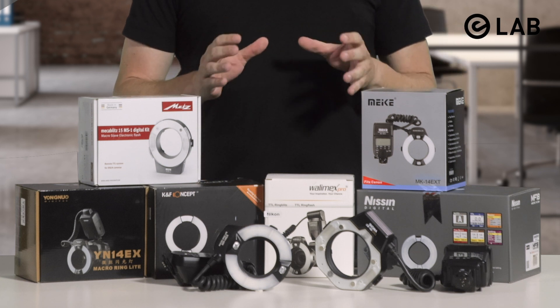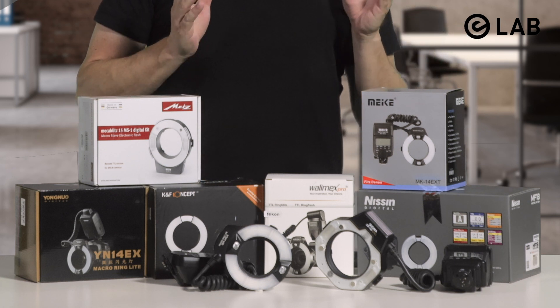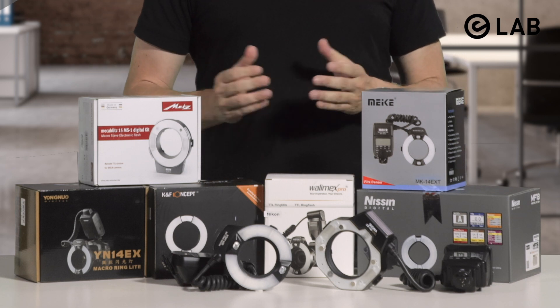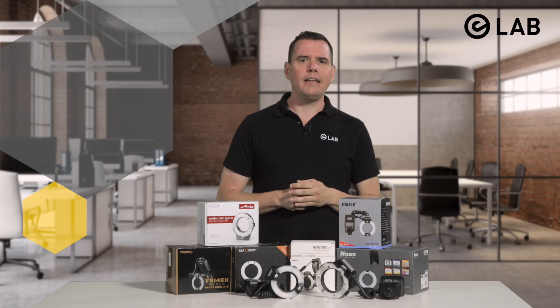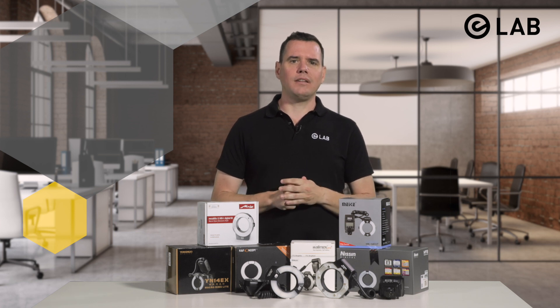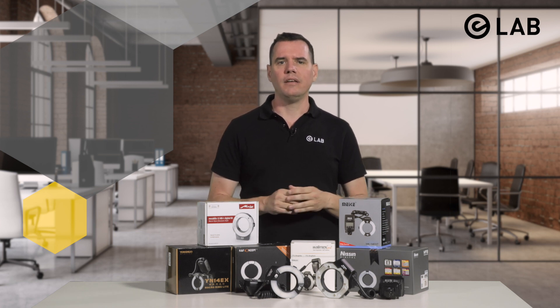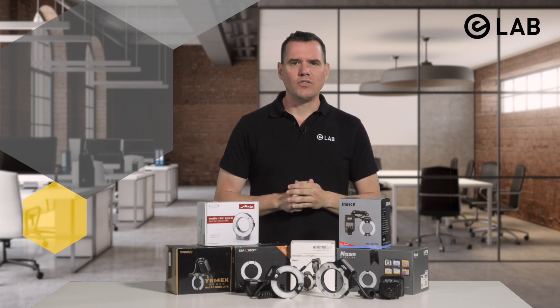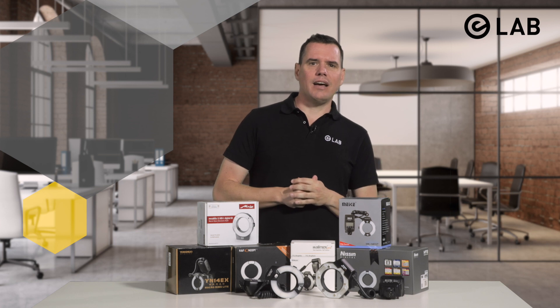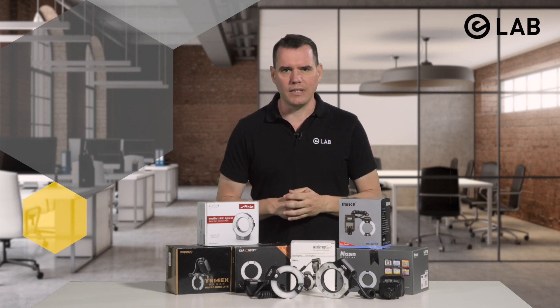There are obviously lots of different ring flashes available from lots of different manufacturers, with the most notable difference being price. It is virtually impossible to test them all, but we focused on a selection of eight ring flashes which are most commonly used in dental photography today. So let's take a look at our eight candidates, ranked by their most notable feature — price.